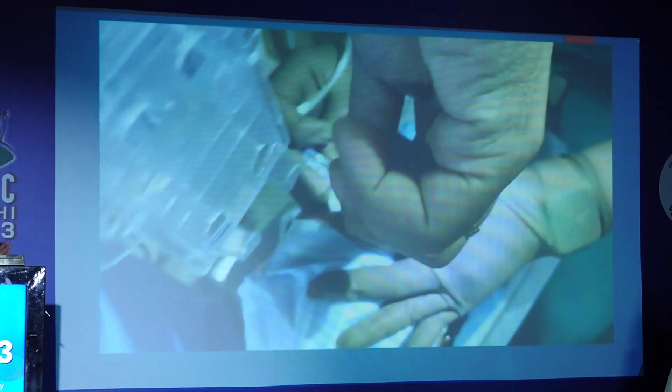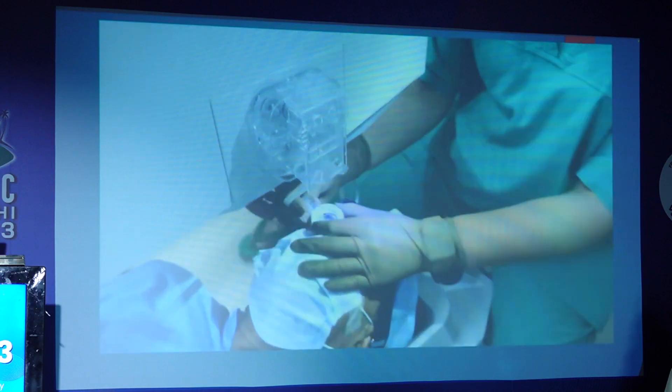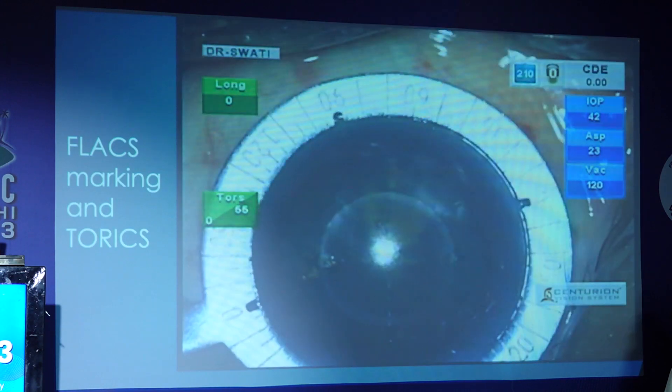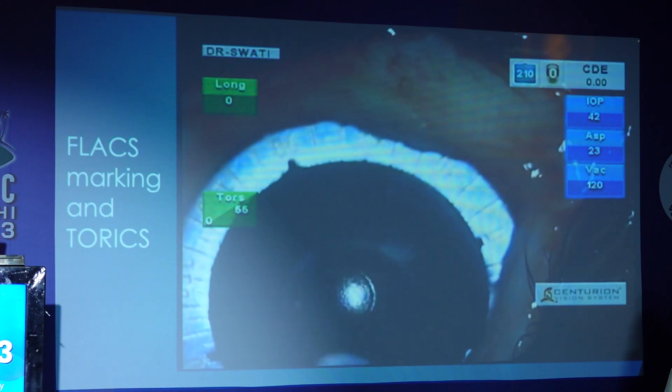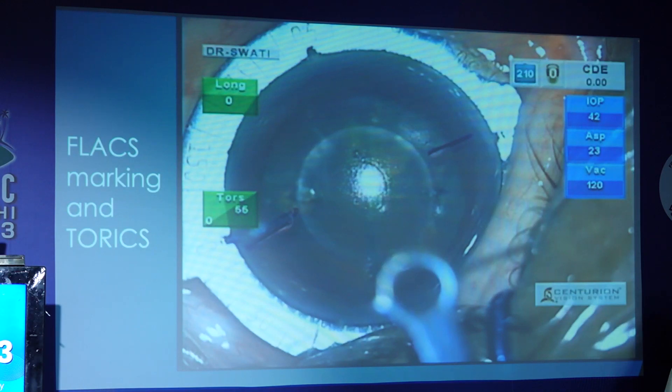After alignment, the docking is done and the femtolaser is proceeded. The K readings are already fitted to the Catalyst nomogram, and the axis — even if you're planning for arcuate incisions — is set accordingly. After the rhexis has been done, I apply the Mendez ring and axis marker here just to cross-check whether the femto marks are accurate or not. There is a faint glow under the reference markings — those faint glows are the femto axis corneal marks. They very much coincide; in almost all my cases they are superimposing and very accurate. These corneal femto marks also help in the post-operative period to verify whether there is any IOL rotation.